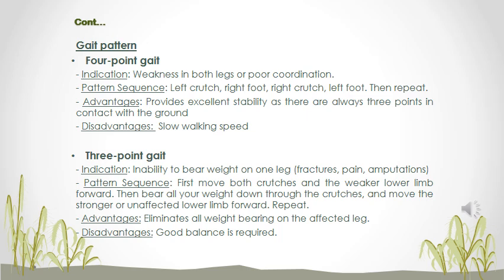You will have the opportunity to practice this and also watch the videos that I'm including the links of for you to understand the gait patterns better. But let's go through it in theory. You have various different gait patterns, starting with the 4-point gait.